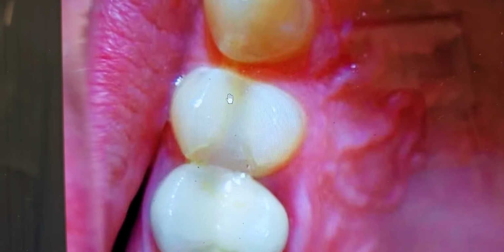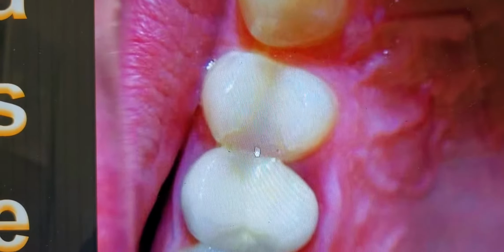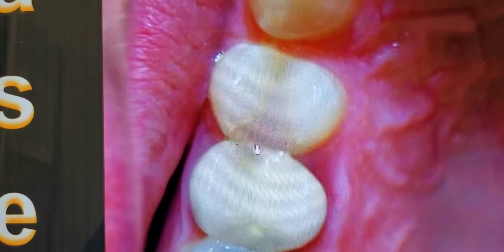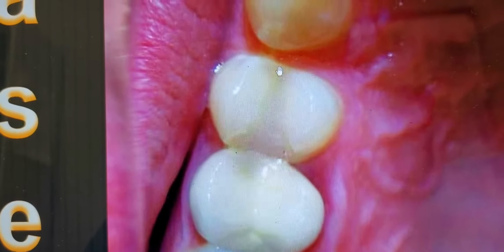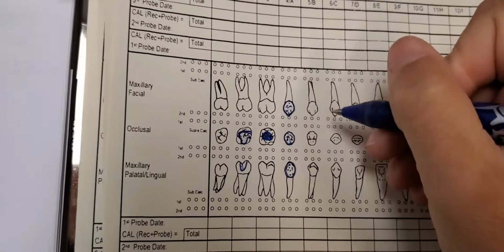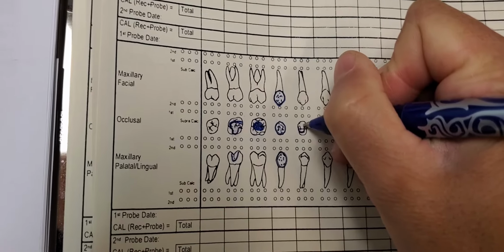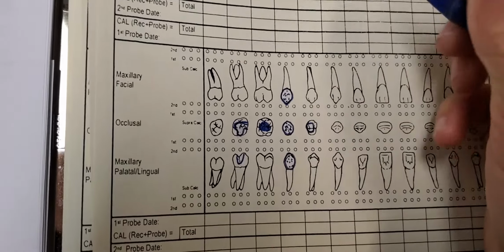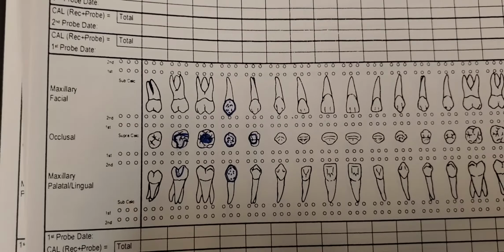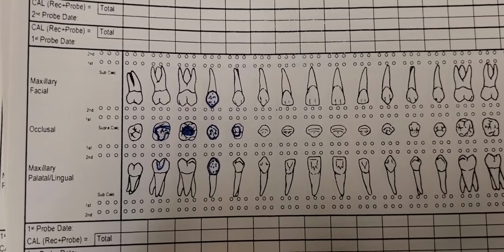Tooth number 5, I can tell is a composite, and I can tell that it is covering the occlusal for sure. It does waterfall or spill over the edge into the distal surface, but on the mesial I can see some enamel on that outer edge. So this is a DO composite. We'll make sure that on tooth number 5 we do touch the distal in our charting, but none of the other surfaces, and it is not colored in. Remember that existing work is charted in blue and suspicious areas are charted in red.